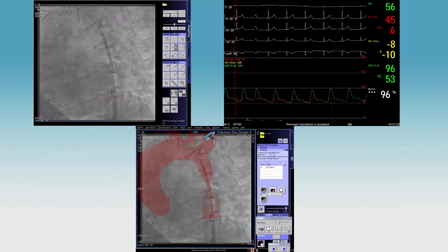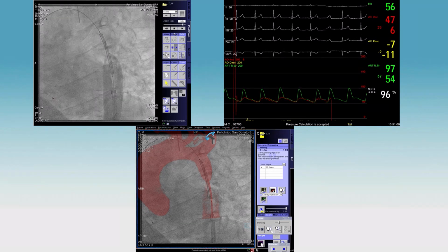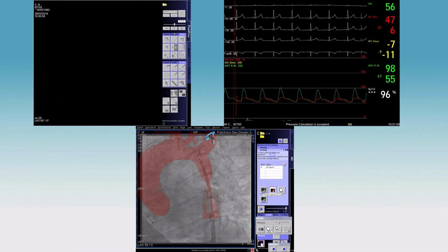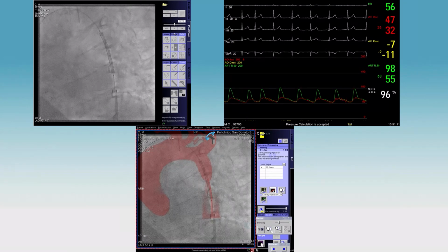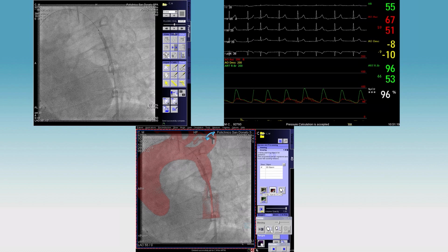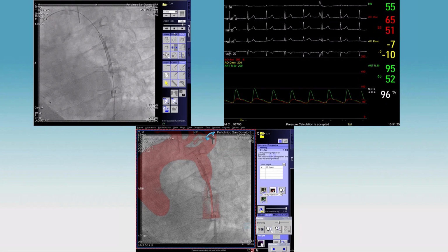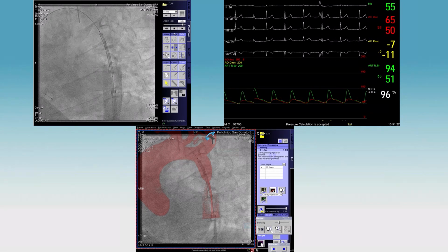Okay. So the stent is pretty much over. We can push up a little bit, about 2 or 3 millimeters. Just want to make sure the top end is... Yeah, that's it. So what do you think? I think we're reasonably happy with that positioning, aren't you? That looks nice. Yeah, Carlos? Yes.